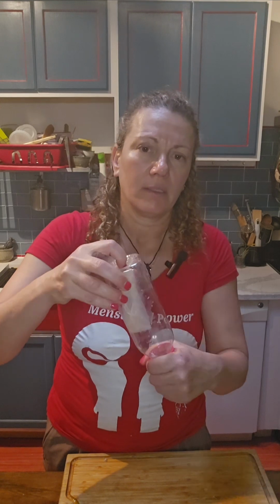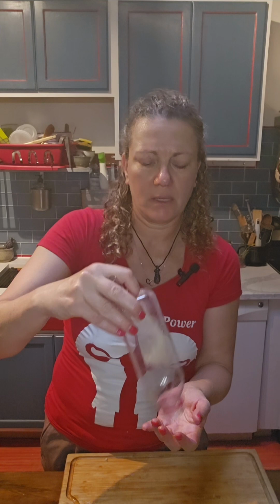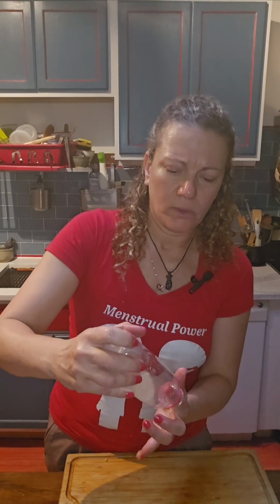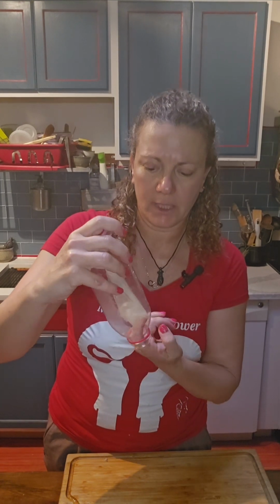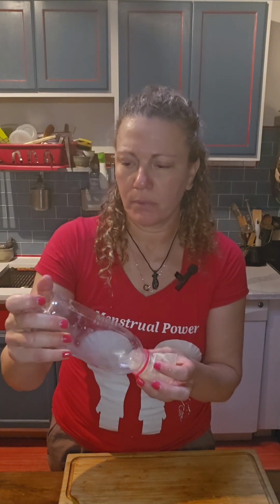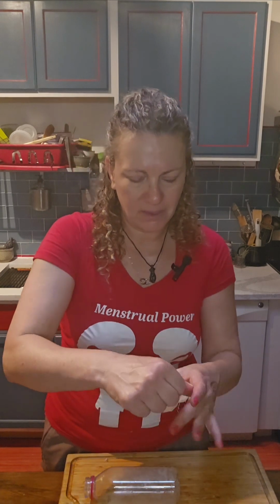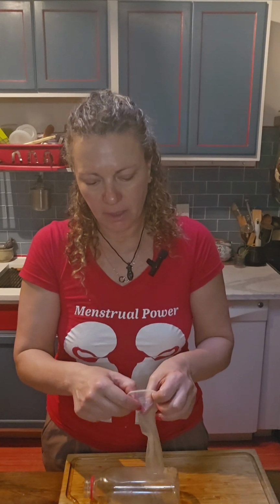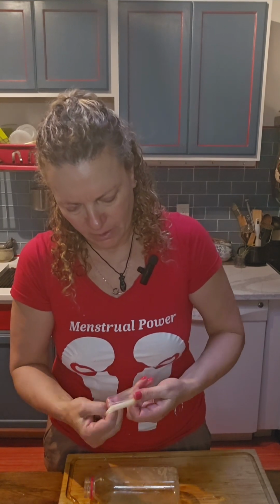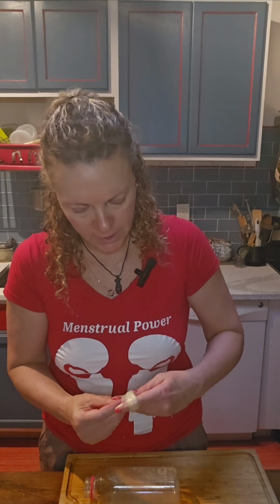And let me take out the cork, the cap, sorry. So the condom has to be long enough that we can catch it from the other side, like this. Oops, okay. This can happen as well, so no worries. So we're simply going to do that again. This time I'm going to try so that it won't release.